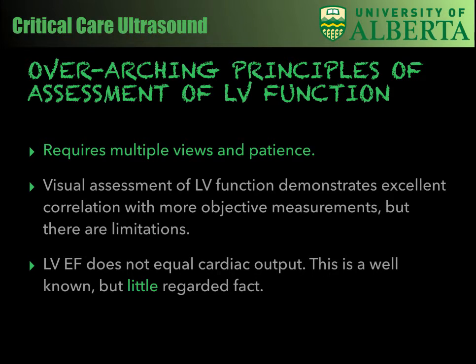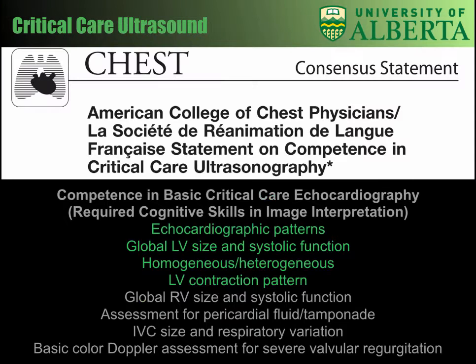And LVEF does not equal cardiac output. This is a well-known but little regarded fact. You may actually have an impaired left ventricular ejection fraction but a normal cardiac output, such as happens in cases of chronic cardiomyopathy. If we refer to the ACCP consensus statement on competence, this is a very helpful document to help guide our approach and framework for focused echocardiography.